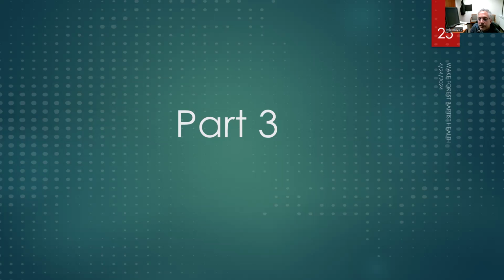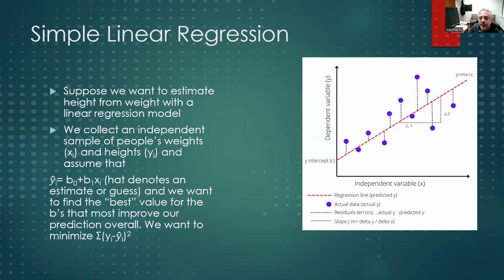Okay. Having said that, I'd like to talk a little bit about how we do it, and about this regression model, which is essentially about finding beta. How do we find beta? How do we know what the best fit coefficient is that we can take our BOLD signal and say, if we took our ideal model signal that matches the task paradigm, what would be the multiplier that weights this towards telling us if that's what we got in our actual measured BOLD signal Y or not?